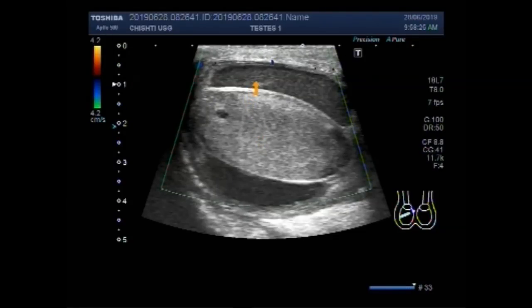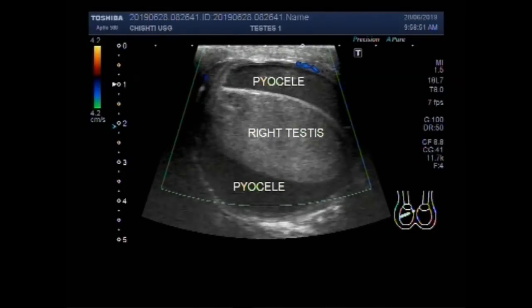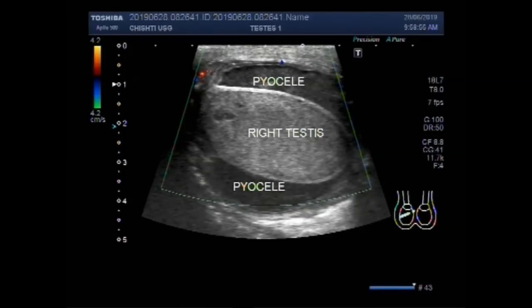Now this is the pyocele. You can see a very thick fluid collection having multiple internal echoes. Again, you can see there is no blood flow seen inside the right testes.